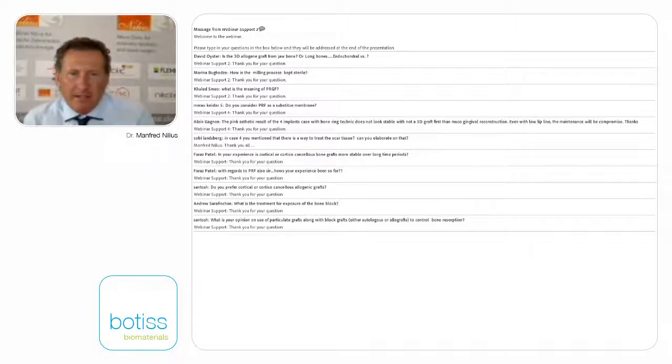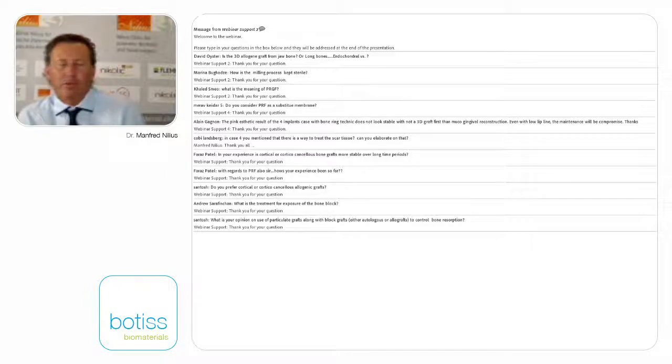Mr. or Mrs. Santos is asking, what is your opinion on use of particulate grafts along with block grafts, either autologous or allografts, to control bone resorption? Yeah, this is a very good idea. I normally use it when I make sinus lifting because the autologous bone is not mineralized and you do not have any idea where is the resorption.